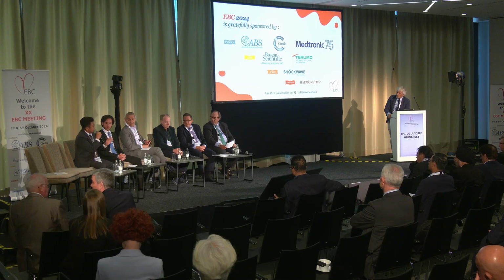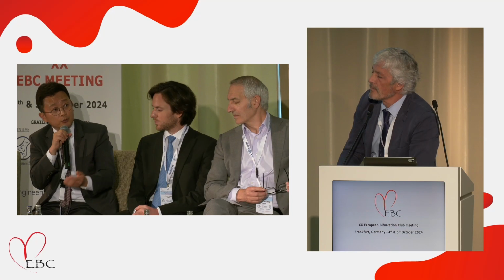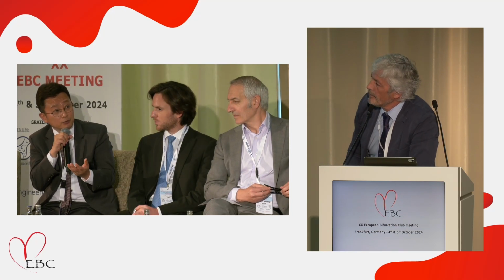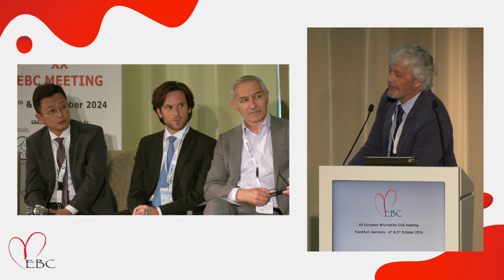I have a technical question. If we put the stent main vessel to the left main to circumflex, then usually the stent malposition occurs in the POC area inevitably. Do you recommend the mandatory final kissing balloon dilatation? Yeah, I think so. Yeah, we did in this case.